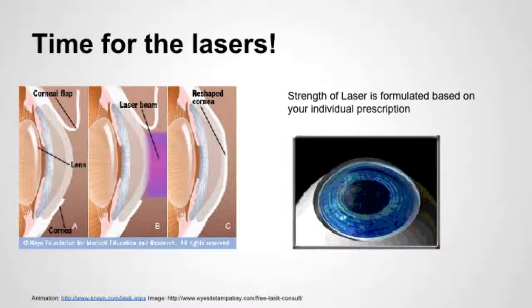Once the cornea is exposed, the surgeon can get to work on shaping it using the laser. For people with myopia, the goal is to flatten the stroma portion of the cornea so that light hits the retina correctly. The number of cells removed is based entirely on a person's unique prescription. The laser beam is extremely focused and can work on an area as small as 0.25 microns. While we may think of lasers as burning, that isn't really what goes on in LASIK surgery. In fact, the laser is simply adding energy in order to disrupt molecular bonds and essentially causes the tissue to disintegrate in thin air.